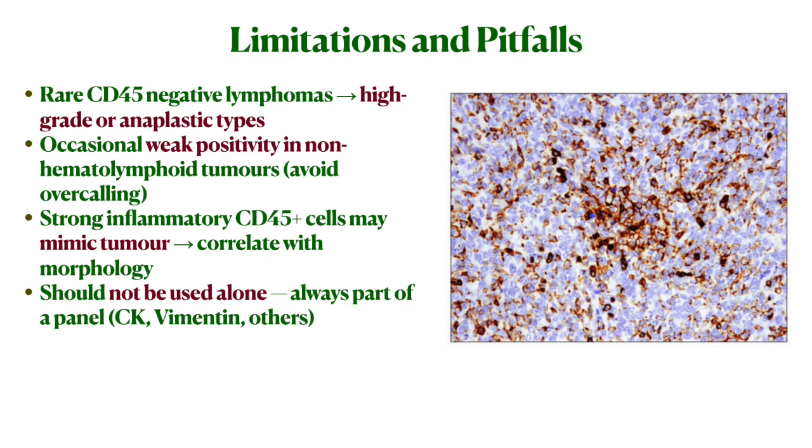Limitation: like all IHC markers, sometimes you can get weak positivity in non-hematolymphoid tumors, and sometimes strong positivity for CD45 or LCA may make us mistake an inflammatory lesion as a lymphoma. Hence you must not use it alone, but you must always use it with a panel.